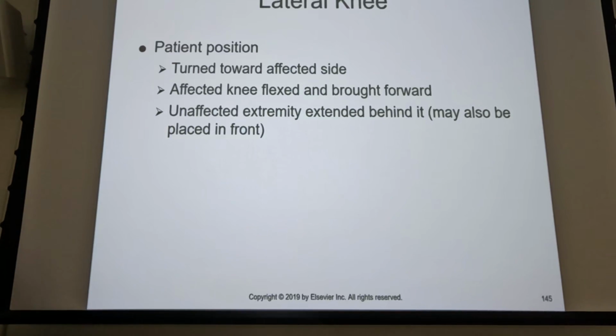That's great. So the lateral knee is one of the harder things to get perfect. You remember the lateral chest x-ray? You always had a little bit of rotation. Lateral knee is worse, okay? So if you ever get one, and you will, when you get one that has no rotation at all, just give yourself a pat on the back. If you have just the tiniest amount of rotation, don't go back and re-blast the patient. These are hard to get, okay?